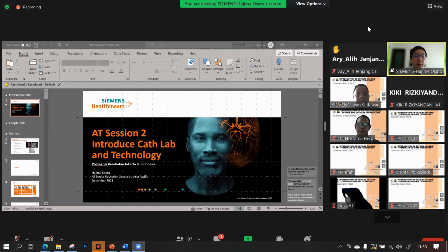Thank you for your question. From my experience, the common frame rate for adult cases is 10 frames per second, as you mentioned. But for pediatric cases, the child has a tachycardia of around 100 to more than 150, so sometimes a high frame rate is required.